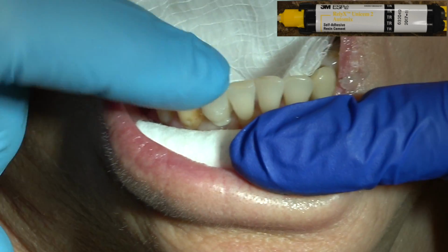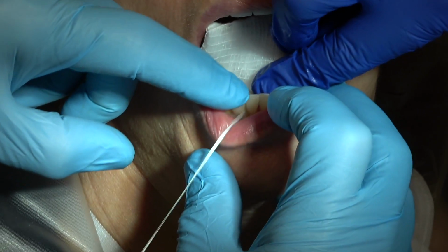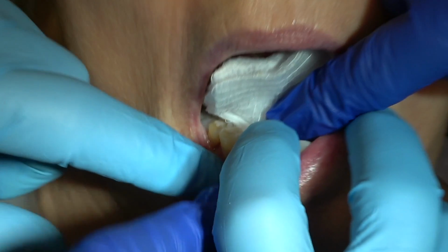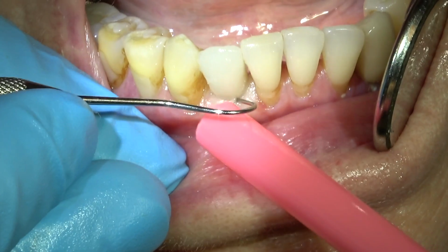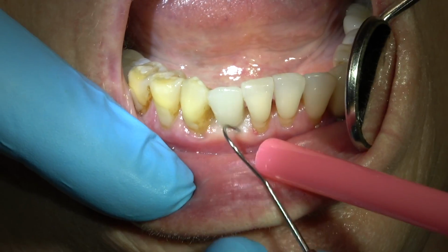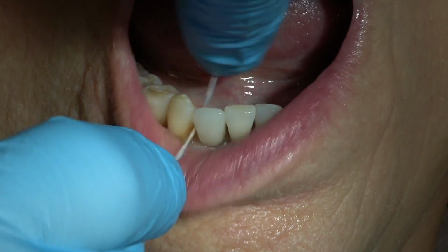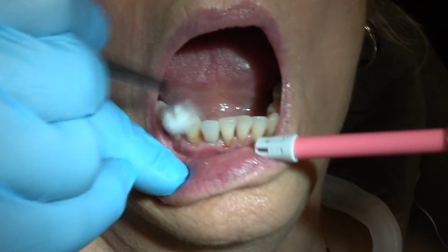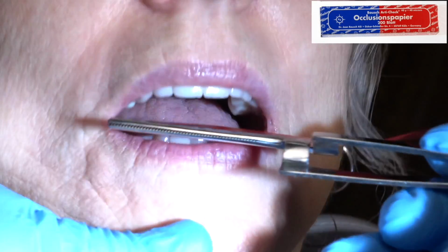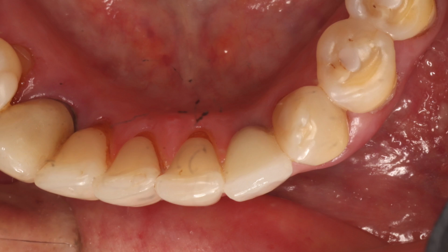Do not remove the excess cement until it has initial set, but do go ahead and floss it so you don't get any of the cement bound in the interproximal area. Now it has initial set, so I have to peel it off. You don't want to wipe it off, you want to peel it off. Then wipe it with a cotton ball. Check the occlusion. There it is, before and after.